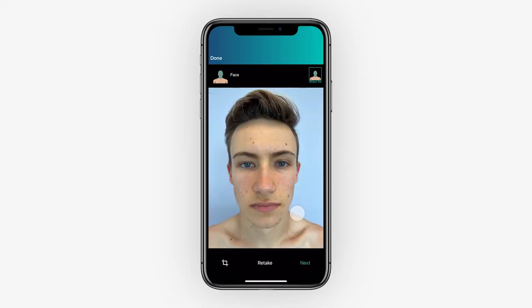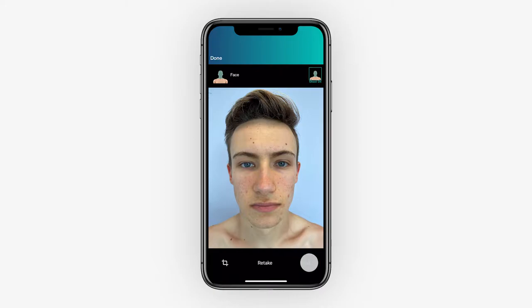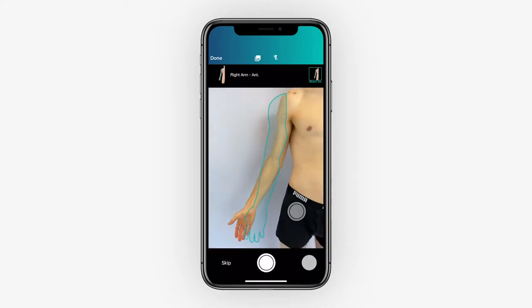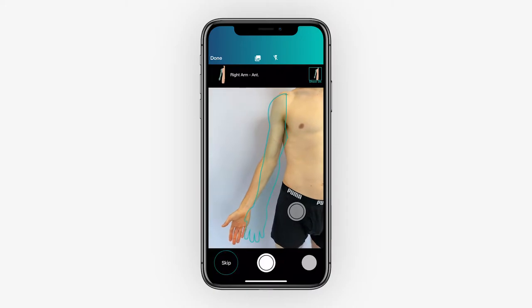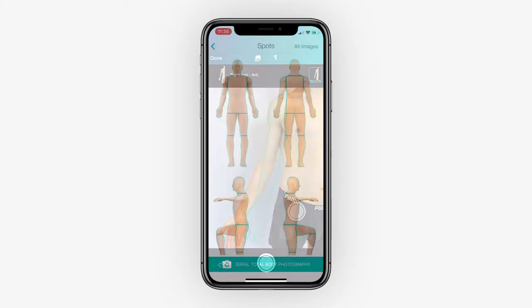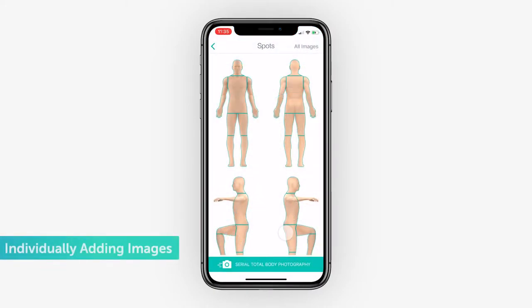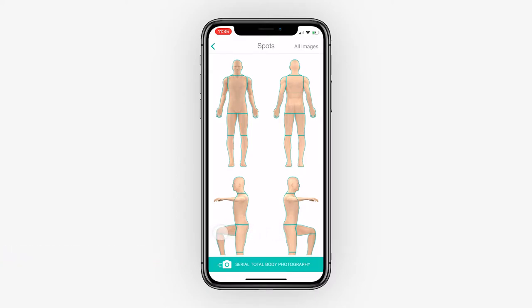You now have the option of cropping or retaking your image. Once happy, press next and continue imaging until completed. You can also skip body parts if they do not require imaging. Alternatively, you can directly select a body part and image individually.